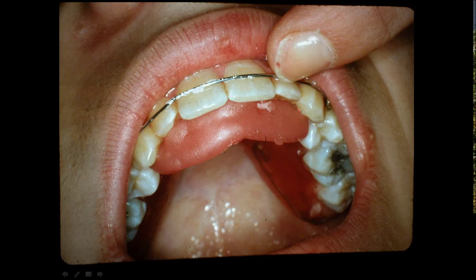You will have the person bite into this retainer, but biting in takes some skill — you've got to have a little sense about what you're doing here. Now that person has to be sitting in a normal head-to-shoulder relationship when they close their teeth. If you close your teeth and move your head forward just a couple of inches, your jaw will move forward. If you move your head backward, your jaw will close backward. You've got one place in here where your teeth close, and that's where your head's in a normal head-to-shoulder relationship — and that's where you bite, because this is going to be where your teeth bite all the time.